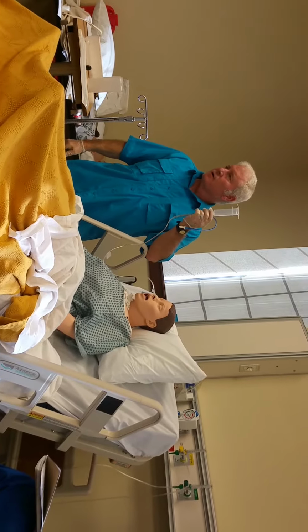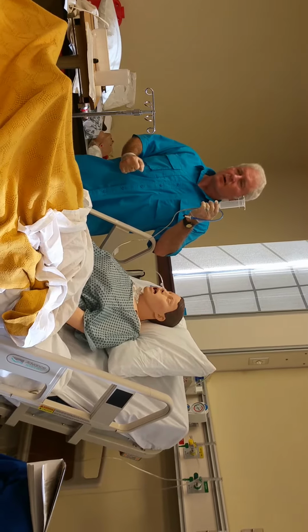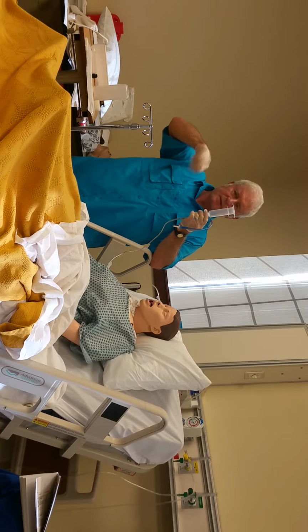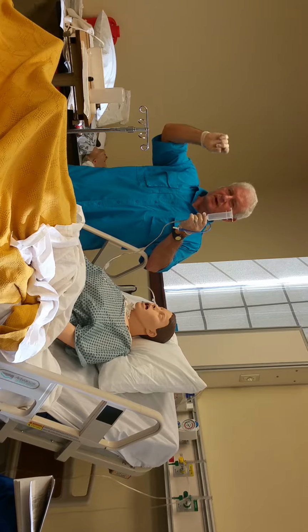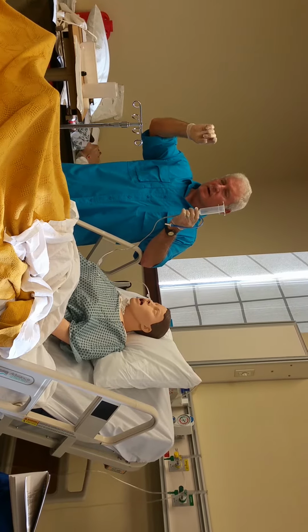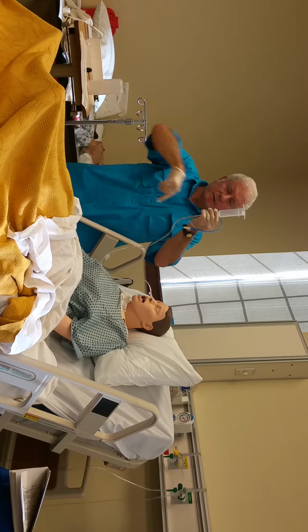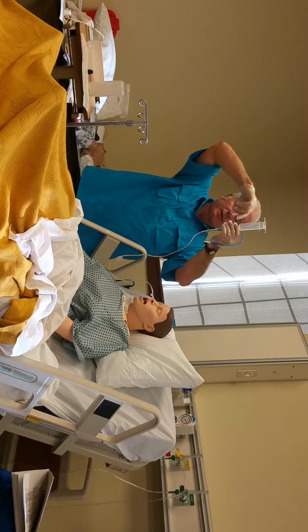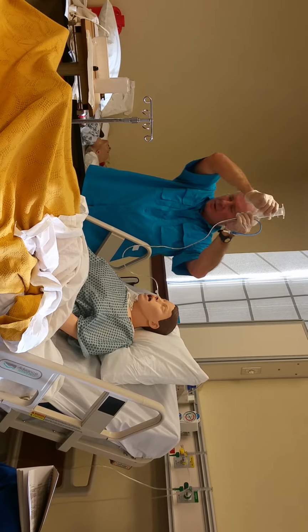Like I said, what you're going to see the nurses do, they don't take time to do all that. They're going to crush everything up all together, put it in the drinking cup with water, mix it up as best they can, and pour it in, and there'll be some powder residue left on the bottom of the cup. They'll just pour some more water in, try to mix it up, and keep doing that until they get all the medicine to go through, okay? And then once they do that, they do 30 mils of water. And once you've got all the water flushed in there, you're good to go.